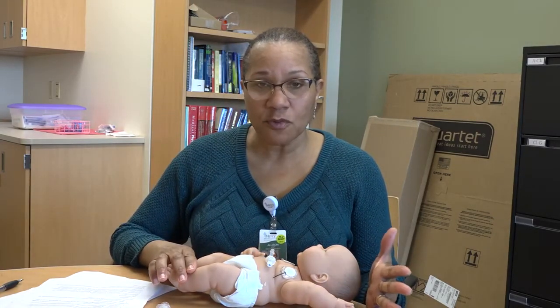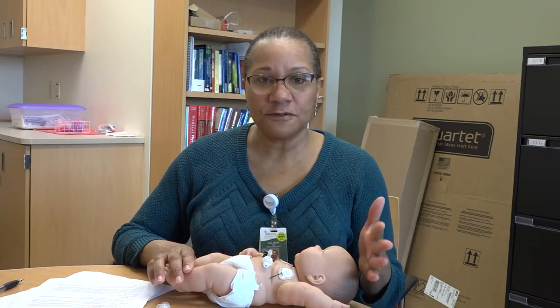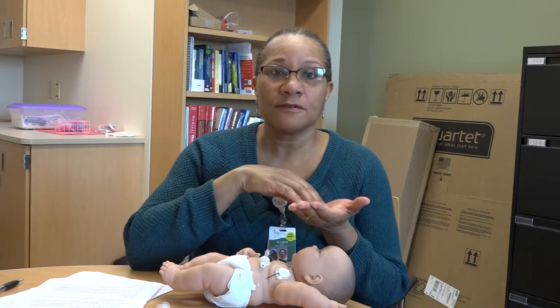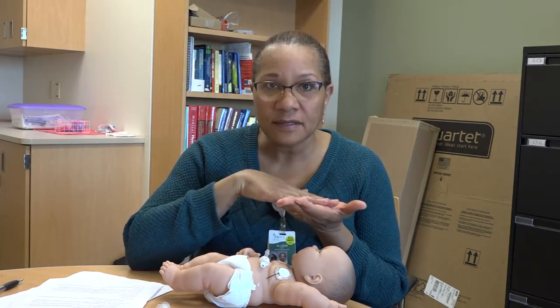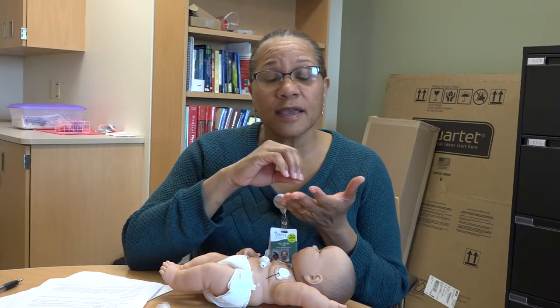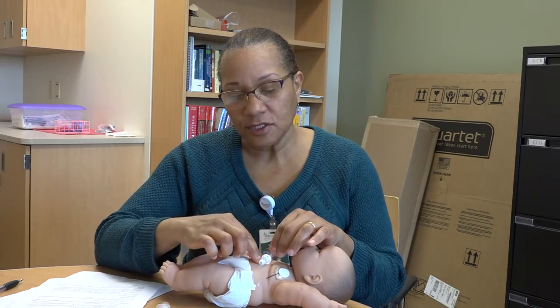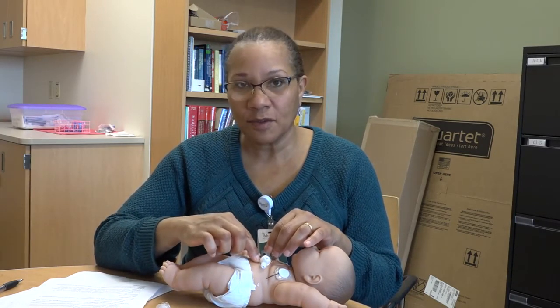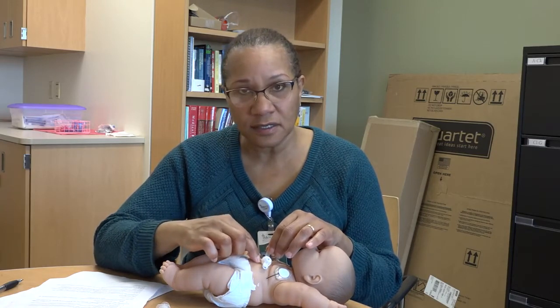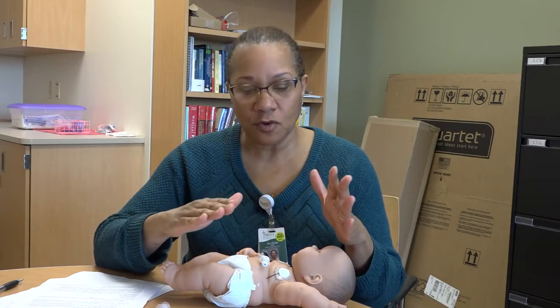Now I want to talk about appropriate fit of the G-tube itself. We don't want the tube to fit too tight, and we don't want the tube to fit too loosely. If the tube is fitting too tight, then we may run a problem of denuding the skin or rubbing that skin raw where the G-tube is. If the tube is too loose and we're getting more gastric contents coming from around the G-tube site, then once again, we're having problems with skin at that point, irritation that can lead to skin breakdown. So we want to be sure that we have the right fit or the appropriate fit.